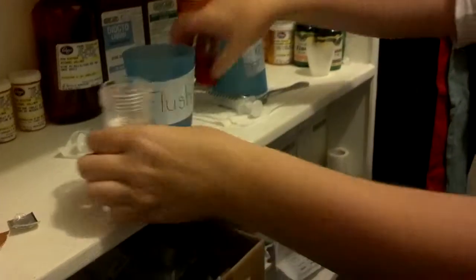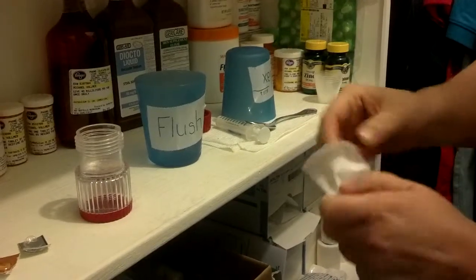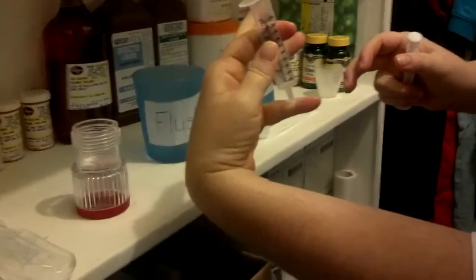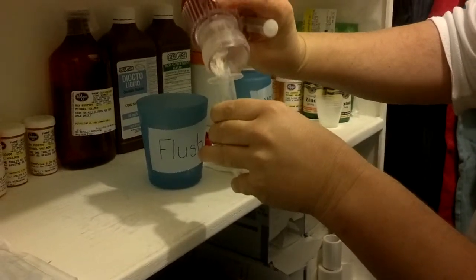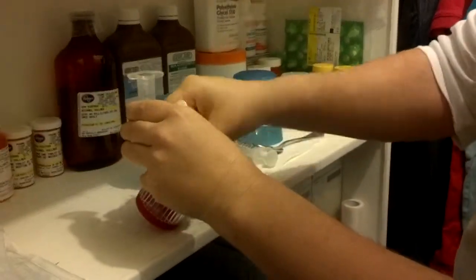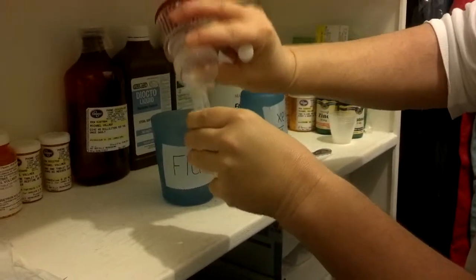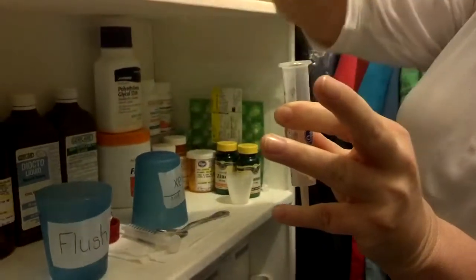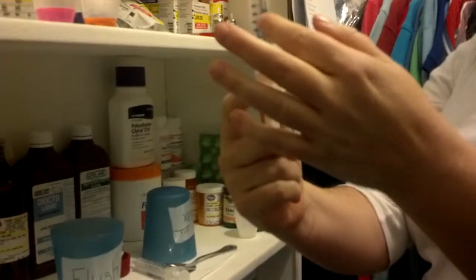So there's my crushed pills. I'm opening my syringe, I take out the plunger, I put my finger over this so the pills don't fall out the other end, and into the syringe it goes. I use my thumb to get the rest of them out. You've got your finger over this to make sure it doesn't go anywhere, put the plunger in just enough to stop it, and then tap down the powder.